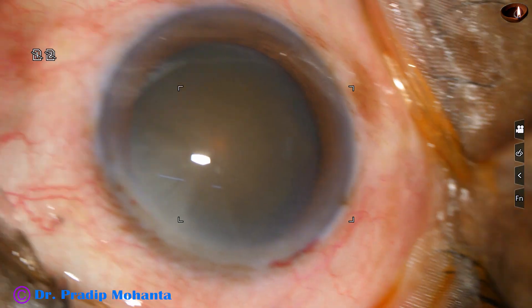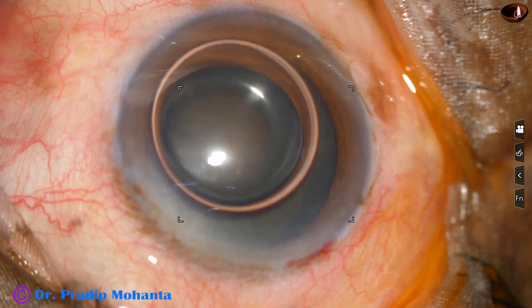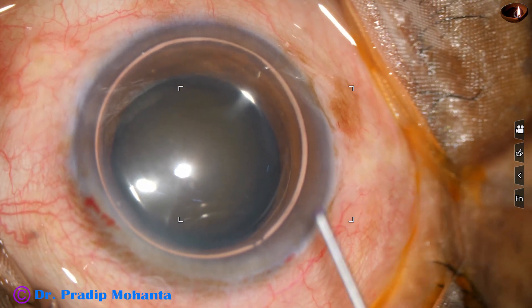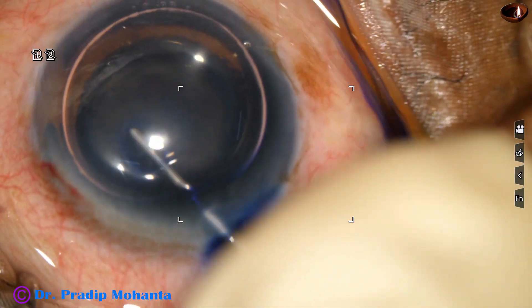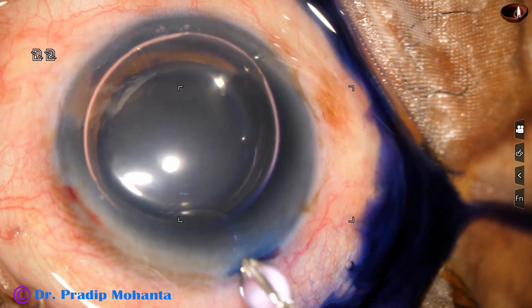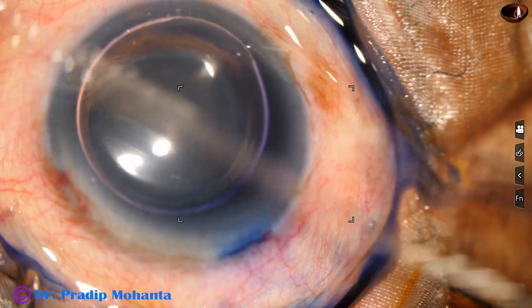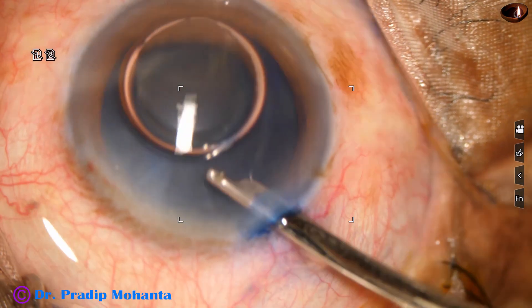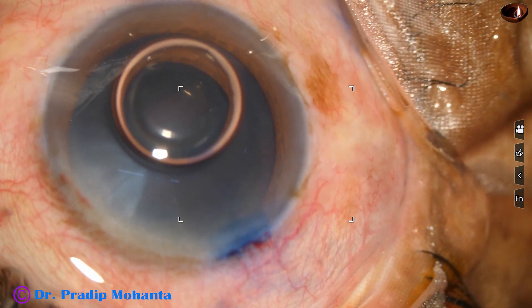My plan is to stain the anterior capsule with trypan blue dye underneath this air bubble. If we use dye underneath an air bubble, the staining is very quick. See, this is real time. I have applied the dye. Now this is a bit of adrenaline. And just after a few seconds, I wash the dye. We can see that there is very nice staining of the anterior capsule.